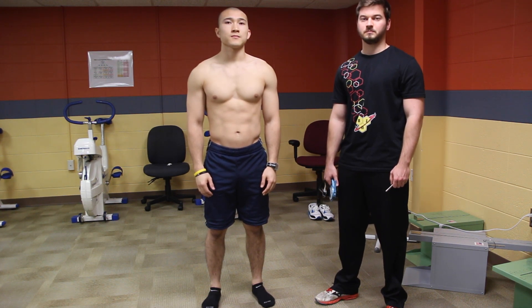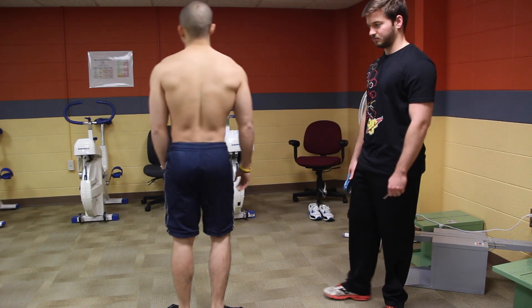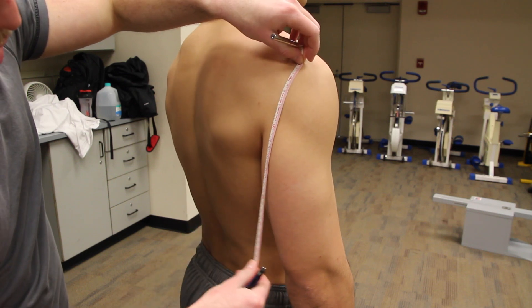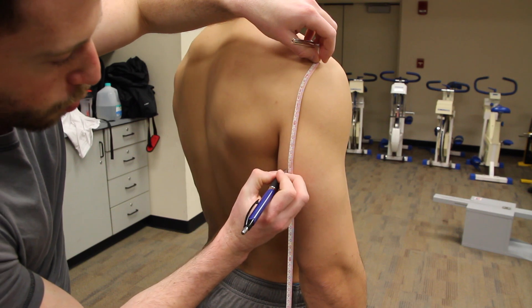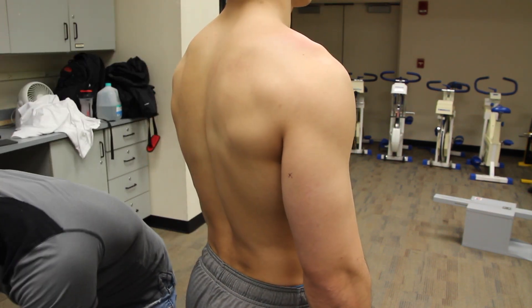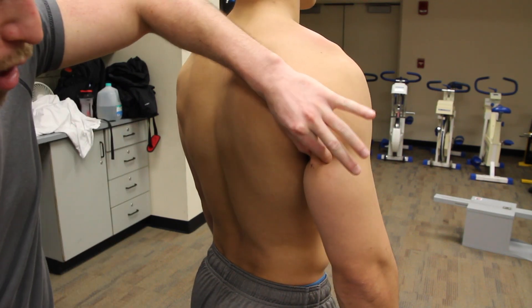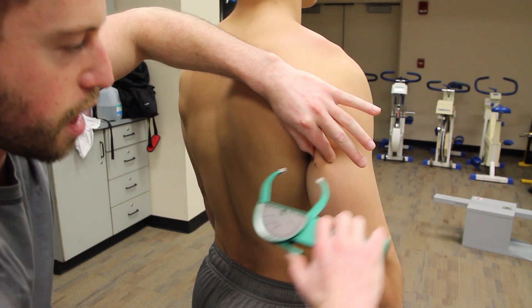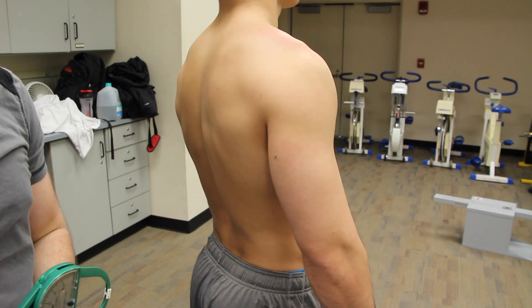To begin, you're going to have your client face away and you're going to do a measurement on their right tricep. For the tricep site, measure the distance from the acromion to the olecranon process and mark the halfway point with an X. Obtain a vertical pinch one centimeter above the pinch site, pinch right in the middle for one to two seconds and release. Make sure to maintain the pinch for the entire duration of the measurement.